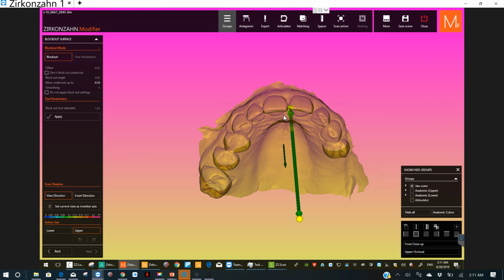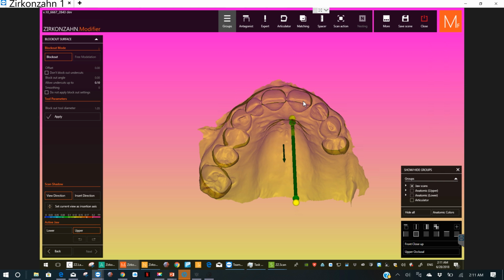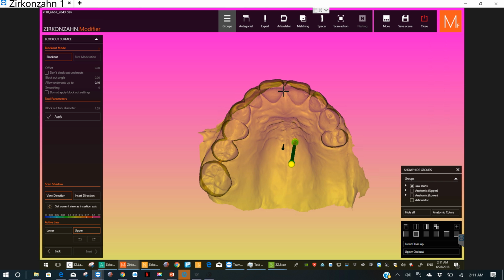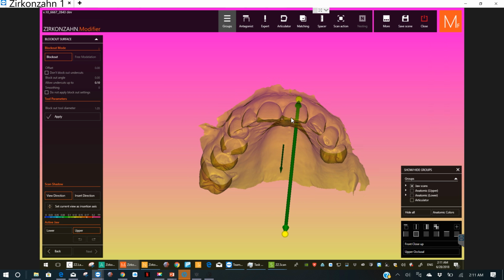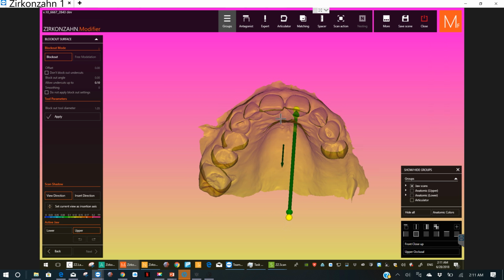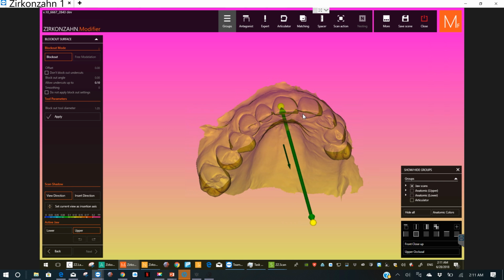There'll be a hollow space under our bridge right there, but you don't want to do this, for example, or you'll have a big edge up there that bothers their lip. This we could fill in with flowable. That in the front would be very tough to deal with, so make sure you can see this outside edge all the way around. Once you find it, and this is the way that the little snap-in thing will be sliding into place.